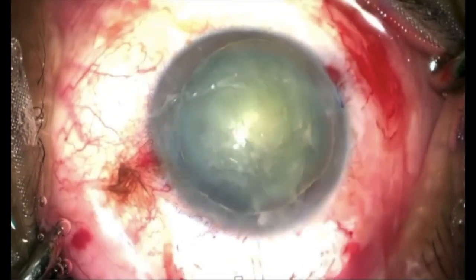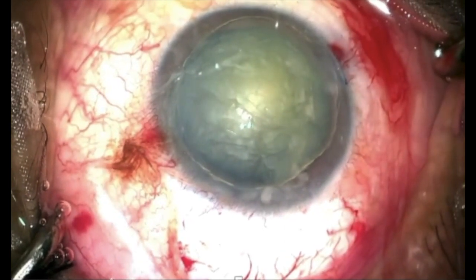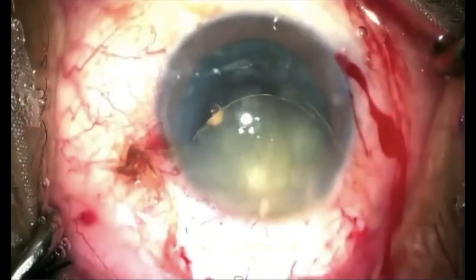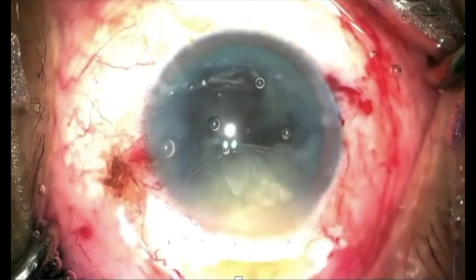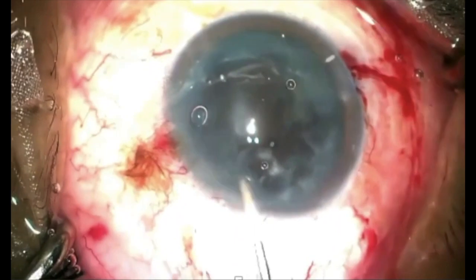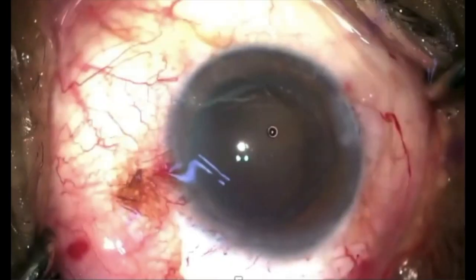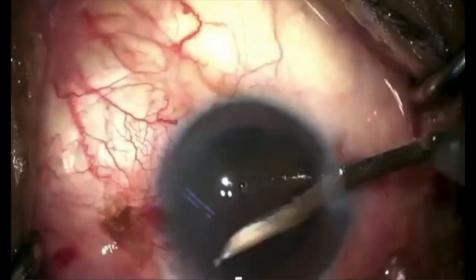As you can see, it is a large nucleus prolapsed into the anterior chamber. Positive pressure is created by gently pushing BSS solution from the side port. Then Morya's 3-way hydrocannula attached to a BSS Plus bottle through the drip set is inserted behind the nucleus under direct visualization, and using sideways motion, the nucleus is stuck in the sclerocorneal tunnel and removed by applying counter pressure at the posterior lip of the tunnel. A nucleus of such a large size is hydroexpressed quite easily.